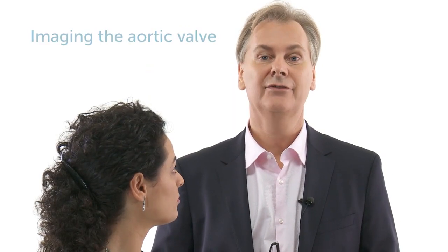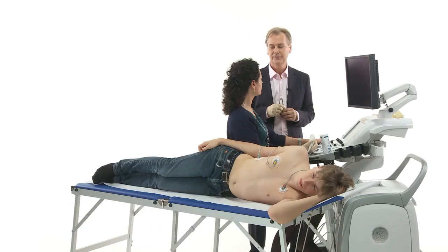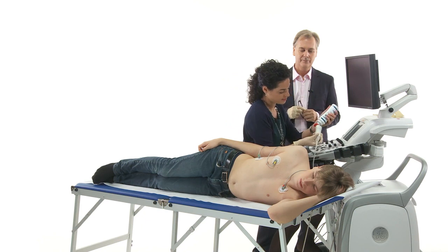You just saw some fascinating video images of the aortic valve. But in echocardiography, we see them a little bit differently because it's a cut plane technique. And we can get numerous different cut planes. The first one we want to show you is the so-called parasternal long axis view. Exactly, Thomas. We can really have a nice image of the aortic valve.